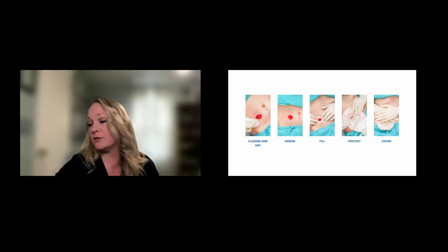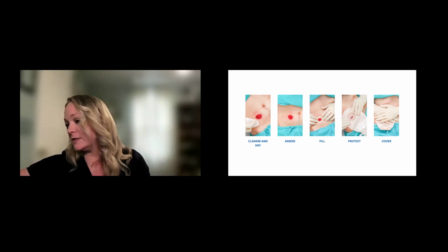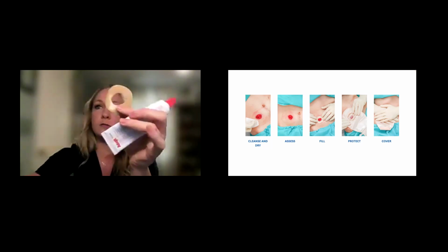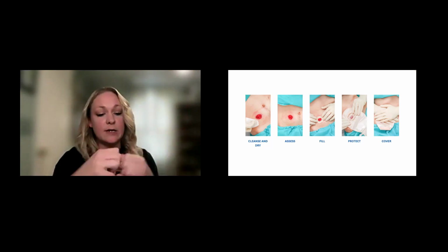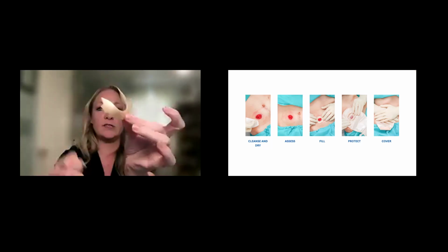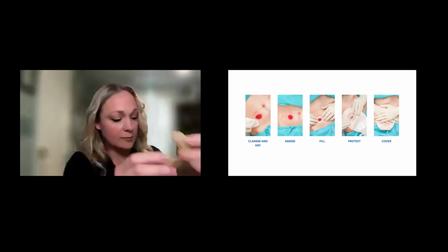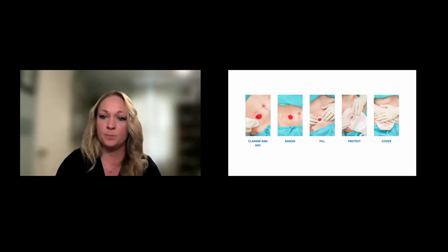Then we'll take a look at our stoma and fill in any of those creases or crevices with our paste or our rings or also our strip. And if you can get creative with this stuff, you can do just a half moon of this. Maybe it needs to be doubled up on one side. So just look at where those contours are and fill them in. Take your time with that, and we'll make sure that the appliance stays on the appropriate amount of time.